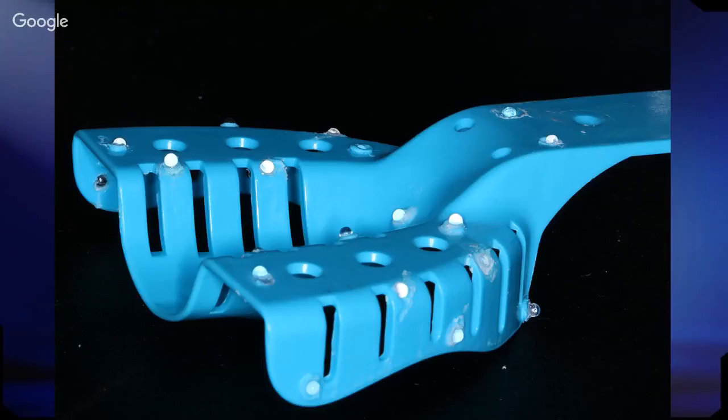But the line of scatter is going to go horizontally, so you want to keep in mind where the crowns are. Anywhere that the crown is in the line of scatter, or horizontal to the projection of the beam, it's going to wipe out your radiographic markers. And this is a mistake that I see a lot of people do. They put the beads right in the middle of the tray. Then when they take the scan, you can't see the markers on the scan. So put them on the top of the tray or down by the rim, even further down if you can than what you see in this picture.